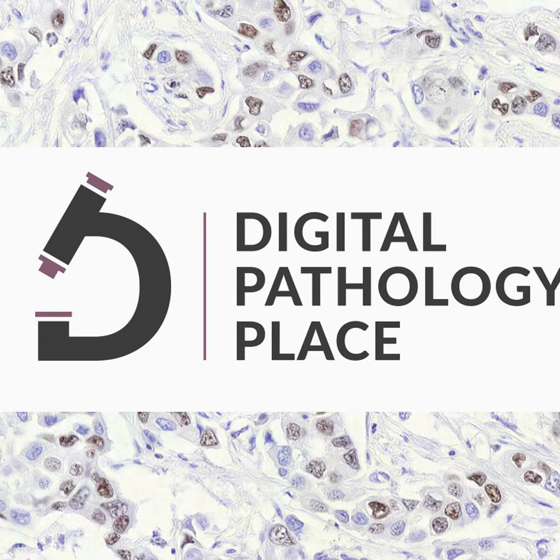So the diagnosis of glomerular nephritis is based on kidney biopsy analysis by nephropathologists. And obviously, as any human assessment, it's going to be subjective, labor intensive, and will include inter-observer variability. We will not get rid of it. Doesn't matter how well you train the people to be aligned. If you have 3 pathologists, if the 3 agree, it's very, very high agreement. Usually we don't agree more than 0.7 when you look at these papers.